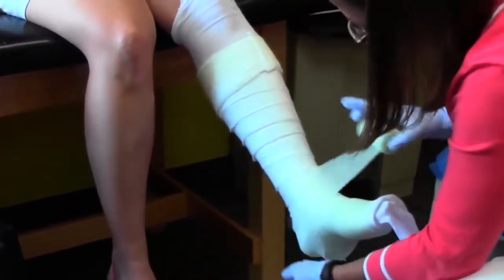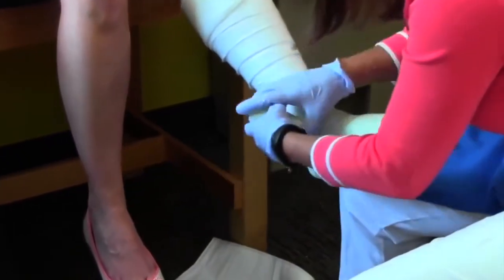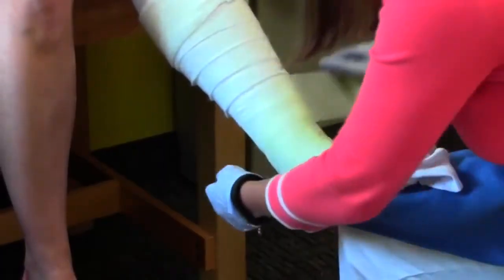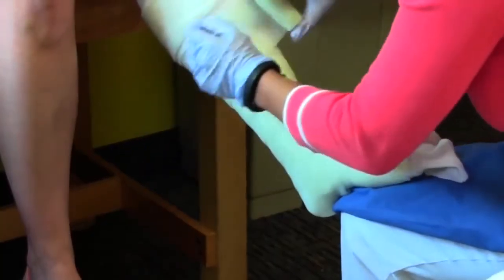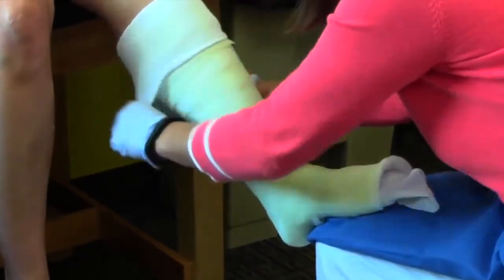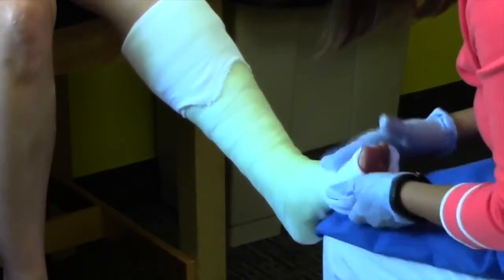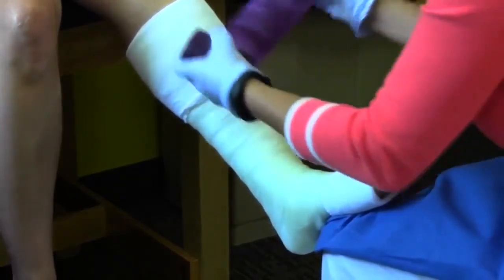You do not want to pull tight. We use a stretch relax technique where you pull the fiberglass out, let it relax as you come down, and set it on the patient so that you're not getting anything too tight. We like to go from one end to the other with the bottom layer and then fold it down. Do not make the mistake of folding your stockinette down over the padding and then not having any fiberglass underneath when you fold it down.